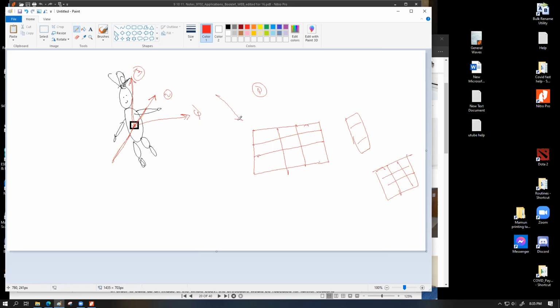Then as you scan in this direction, how many numbers are you going to have? This diagonal list will have how many numbers? Have a look. You're going to have 5 numbers. Why? One set of rays will pass through this direction, one set will pass through this diagonal direction, one through this diagonal direction, and then this one, and then this one. So you're going to have 5 different numbers over here, and you'll have to add these 5 different numbers with 5 different alignments of these boxes.